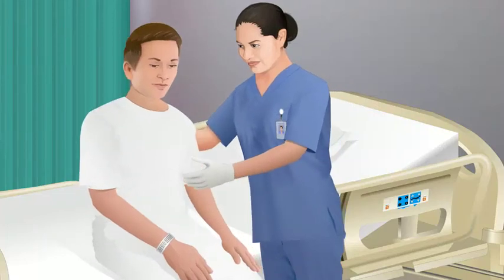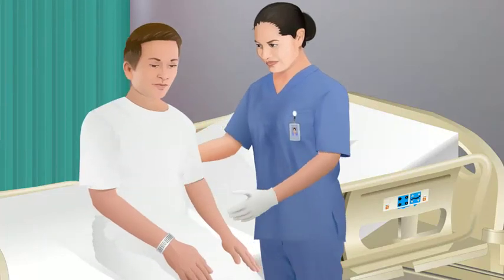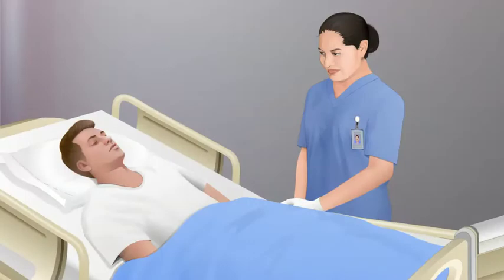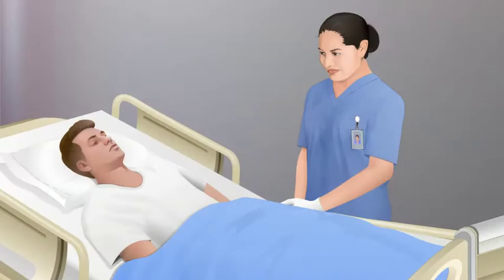Instruct the patient to sit erect in bed or in a chair facing the nurse. A young child or a patient who is acutely ill may lie back against the bed with the head of the bed raised.